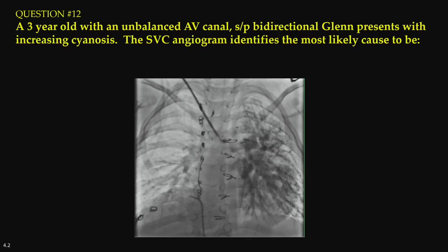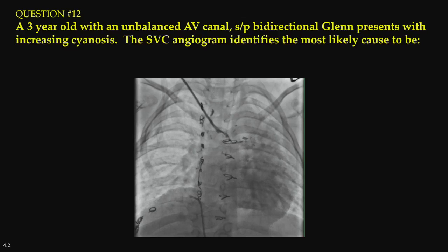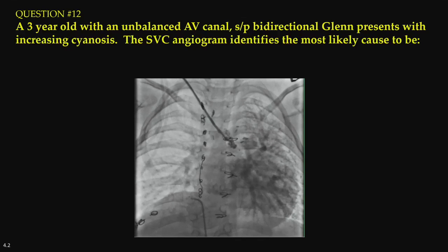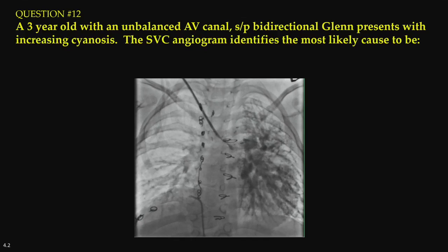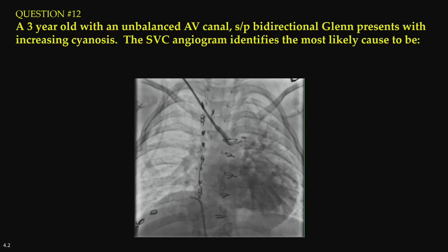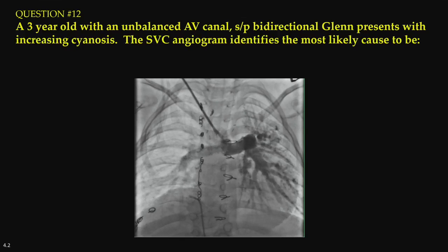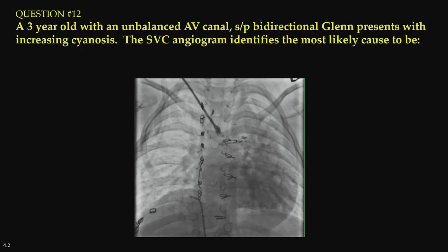You can also see she's a setup for that because without hepatic factor going through the lungs as a first pass, she's at risk for these. So she's a 3-year-old post-Glenn, and so she's at risk for pulmonary AVMs. We don't see any decompressing veins on this. We don't see a stenosis of the Glenn. It doesn't show. And then aortopulmonary collaterals, we would see wash-in.